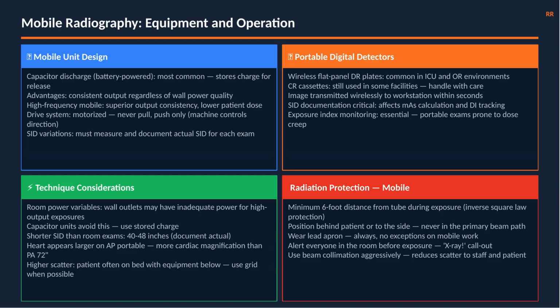SID must be measured and documented for every portable exam. It affects mAs calculation and DI tracking. Exposure index monitoring is essential. Portable exams are prone to dose creep.